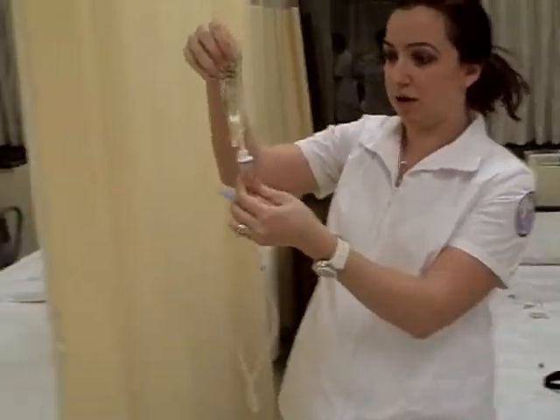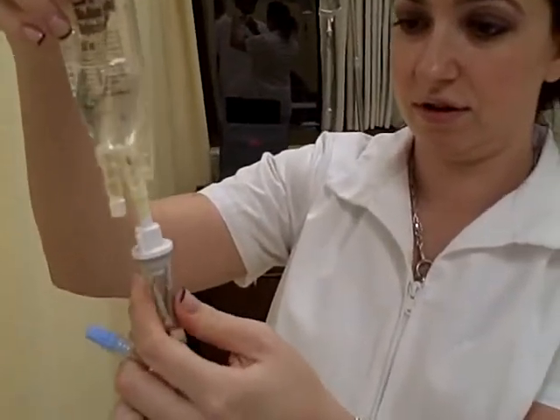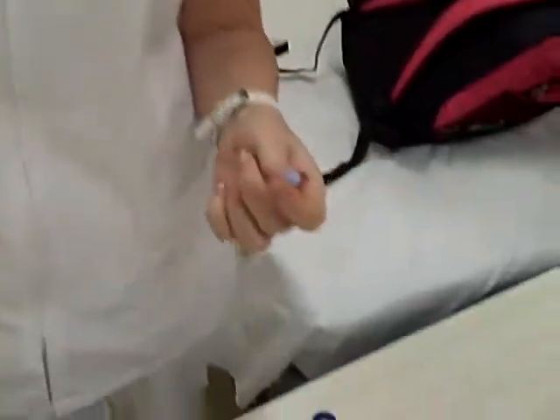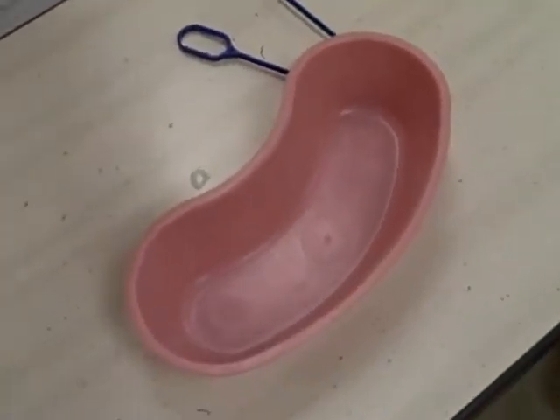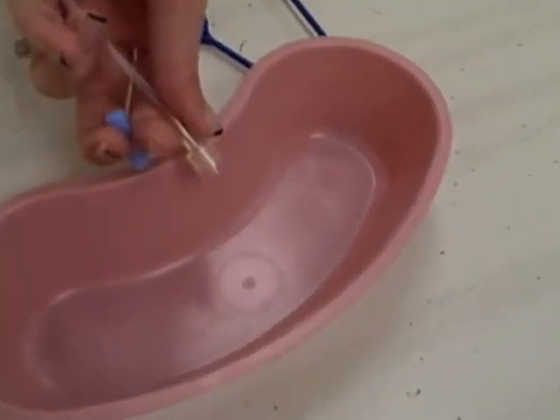Then I'm going to apply the medication. I'm going to make sure that I don't waste that much medication and that this tip stays sterile. I'm just going to make sure there's no bubbling in the tubing.